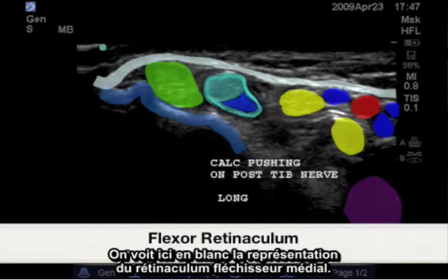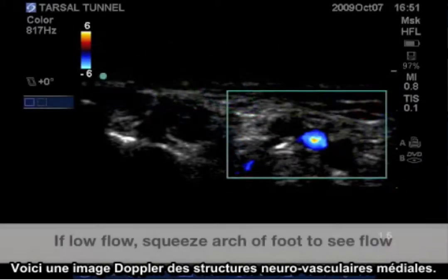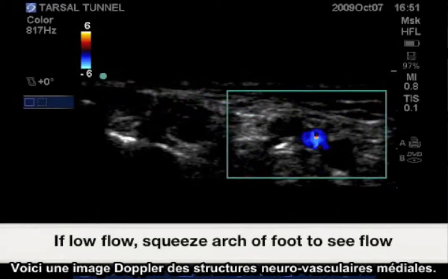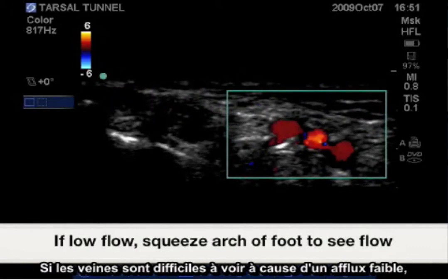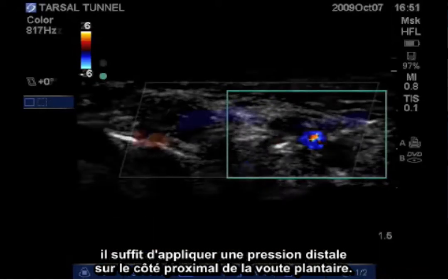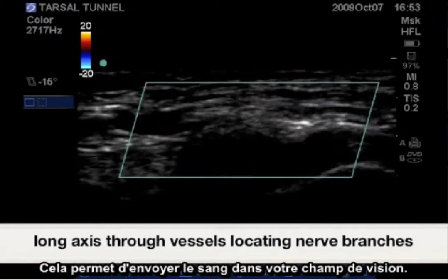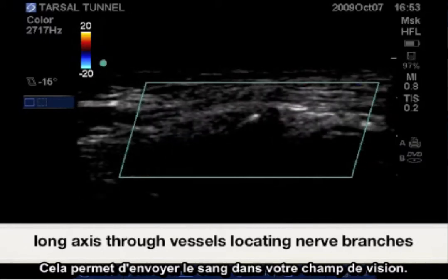Highlighted here in white is the representative medial flexor retinaculum. Here is a Doppler view of the medial neurovascular structures. If you notice that the veins are difficult to see due to a low flow state, just apply distal pressure at the approximate arch of the foot. This will force blood up towards your field of view.